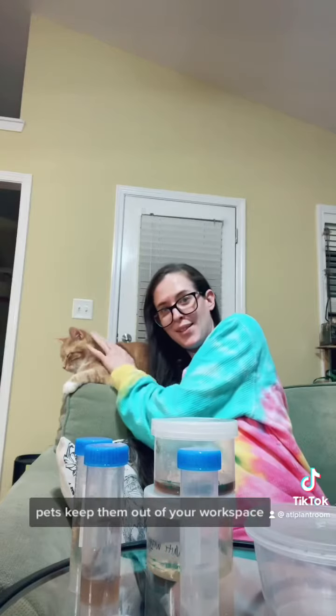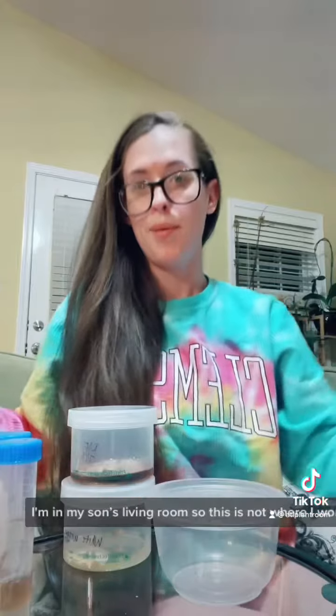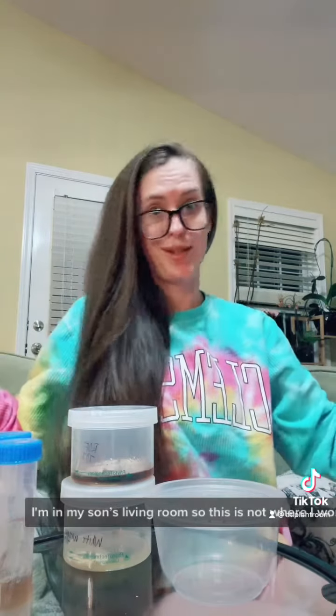Containers — you have to use a certain plastic and put these in the autoclave. Pets: keep them out of your workspace, they are contaminated. I'm in my son's living room so this is not where I work.